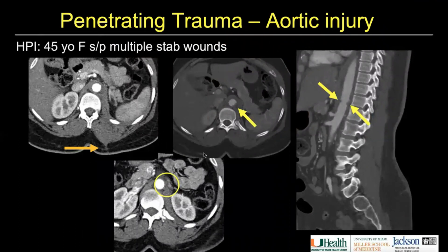Another patient with a penetrating injury, a stab wound in the left back: the trajectory goes through the retroperitoneum towards the abdominal aorta. There is irregularity from intimal flaps of the abdominal aorta and periaortic hematoma in this patient that was treated with endovascular repair.